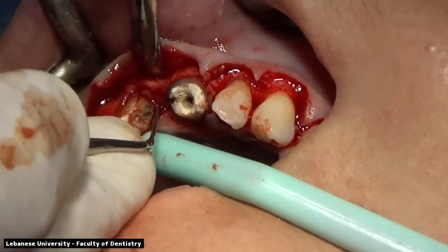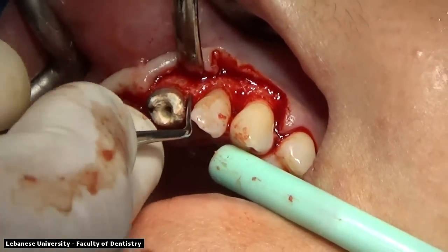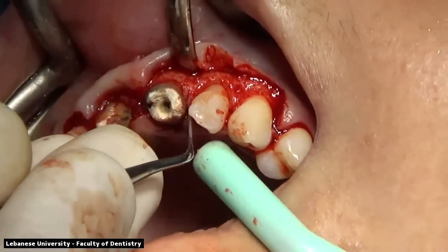The root is moving at this point, so we can feel that the root is moving. What we're going to do is make sure that the periotome is going all the way to the apex of the root itself.